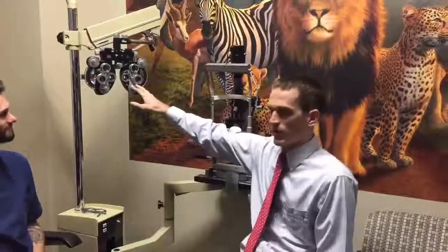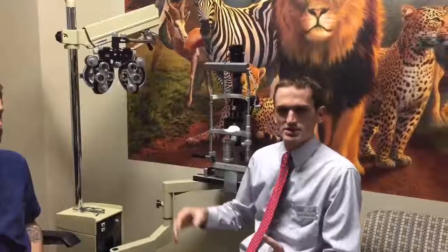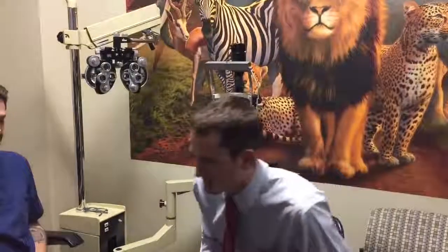And just a quick tip about that, a lot of patients don't know this, but the goal of checking for glasses in a phoropter for an adult is to get to 2 choices that are about the same. And that doesn't mean that if you see 2 images that are about the same that you've failed the test or anything like that. It means that we've done our job. So that's the end point of checking for glasses for adults, is 2 images that look about the same. But for kids, it's a different story.